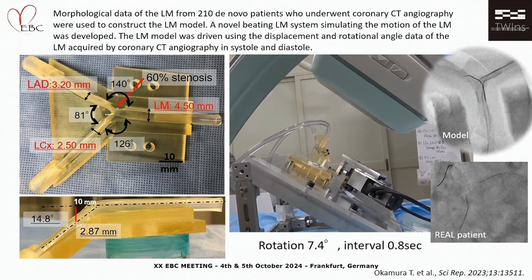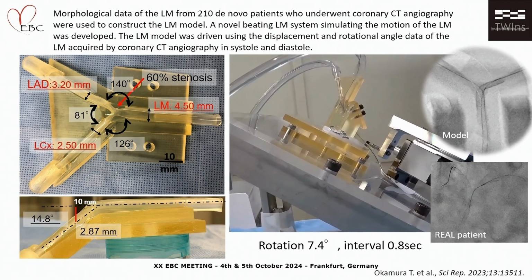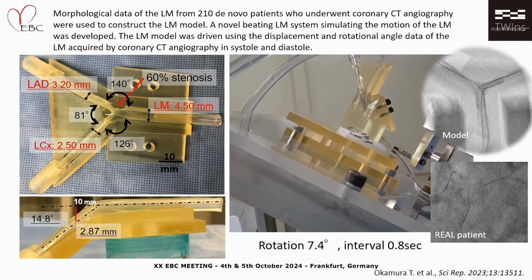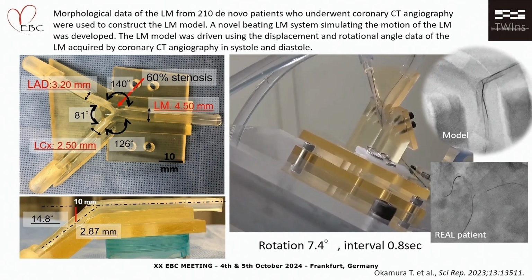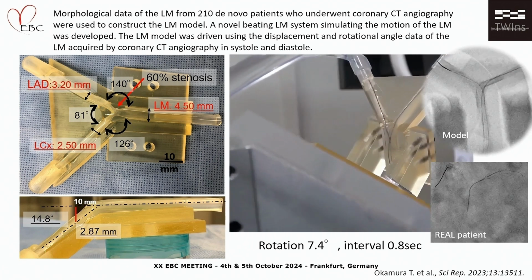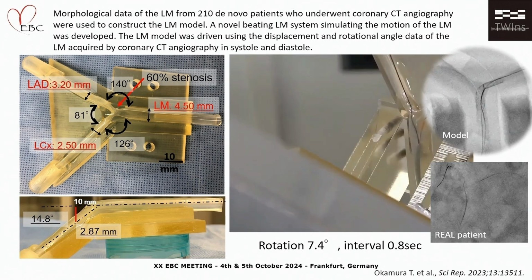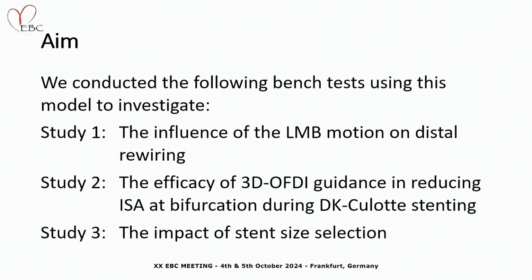We developed a novel beating left main system that simulates left main motion using systolic and diastolic morphological data from 210 patients who underwent coronary CT angiography. Using this model, we conducted 3 bench tests.